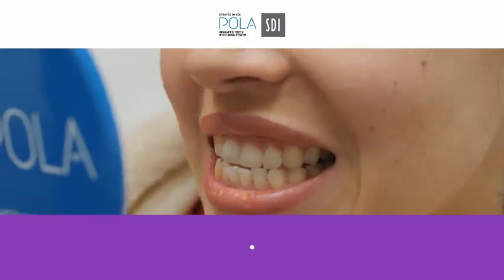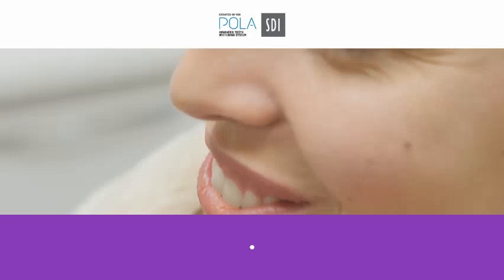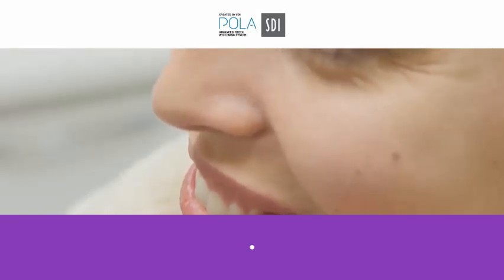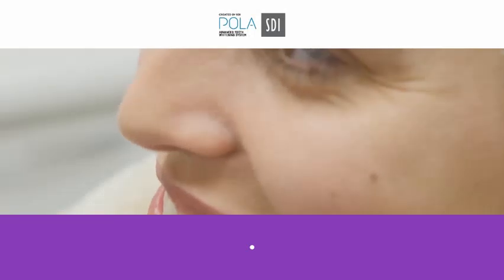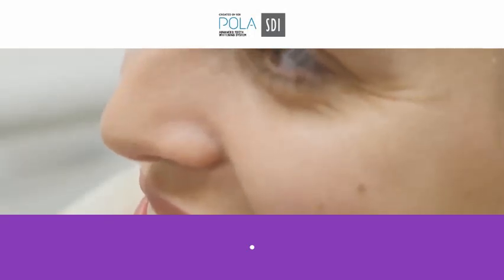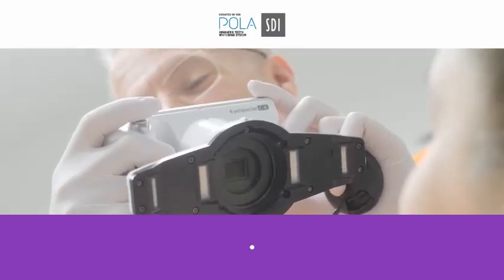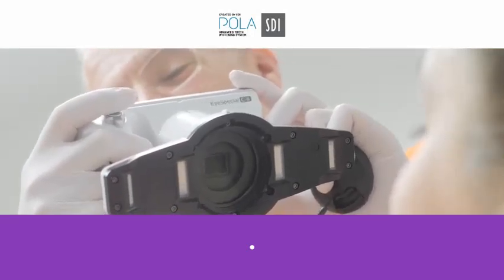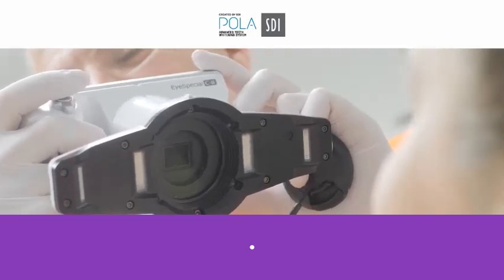The nice stripe on those teeth is why I do the top ones first, because they're a thicker tooth. If you do the bottom ones first at the same time, the teeth will whiten too quickly and you'll suddenly have this real stripe permanently. But now what we can do is bring those forward slowly, and the bottom ones will whiten within 1 or 2 weeks, really quickly. But they're often the ones that are really sensitive, so you don't want to whiten those for as long.